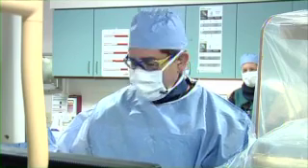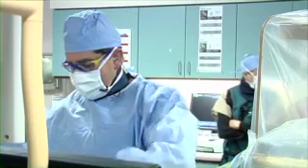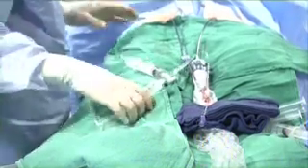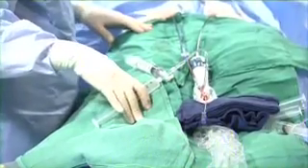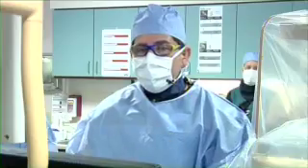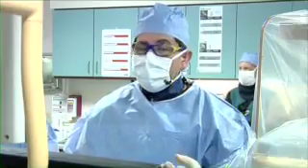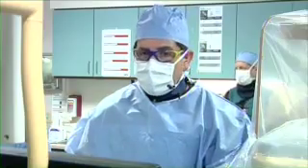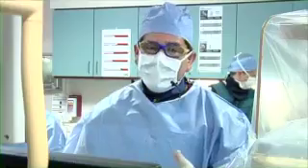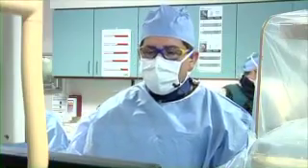And is there someone you would not close a PFO on, that you thought was a cause of their stroke, because of a clot somewhere? If the patient had a clot in the left ventricle or on the left atrial appendage, then it's a difficult position because you're going to be manipulating the device inside the left side of the heart, and you don't know if it's the left atrial appendage with a clot inside their heart, or the left ventricle, the apex of the heart with a clot, and not the PFO. So you have to be certain that this is the real reason why we are here.